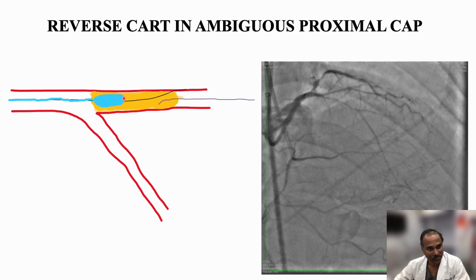So direct this wire towards the end of the balloon. So it's an end balloon technique, and avoid coming beyond this point to minimize injury to this area, so that you don't lose the side branch. So this is the care which we have to take.